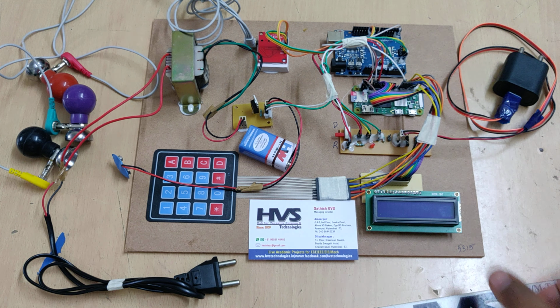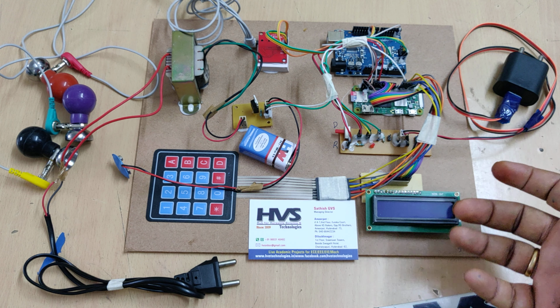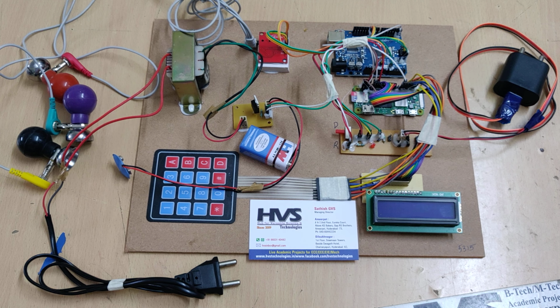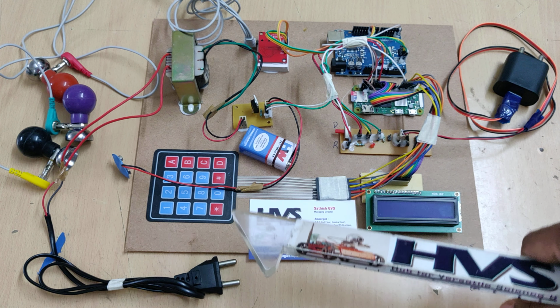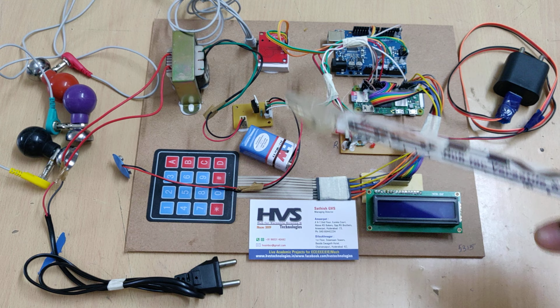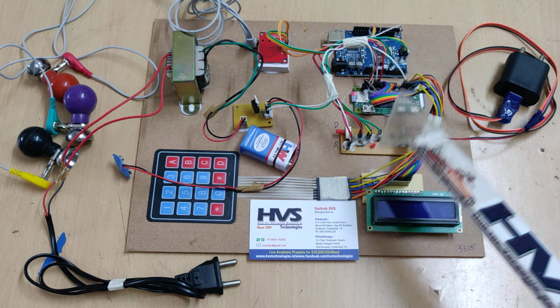Coming to the dataset mode, as we know, in order to find these diseases we should place the electrodes on a diseased person only. So here we have coded the Raspberry Pi with predefined diseased datasets, which we downloaded from the Kaggle datasets. We have loaded five datasets in it.